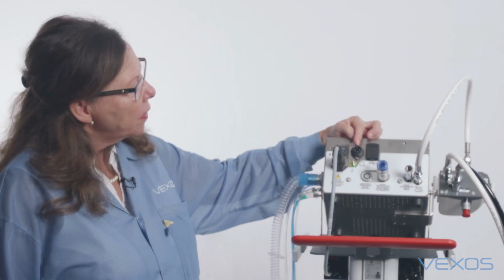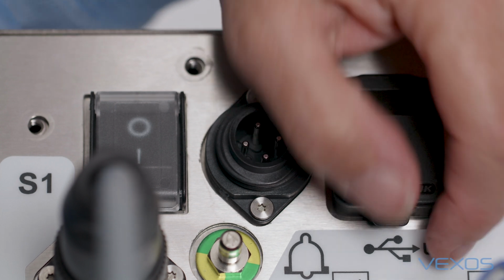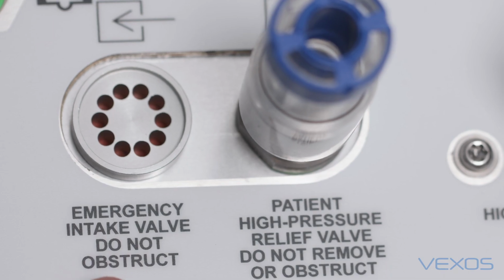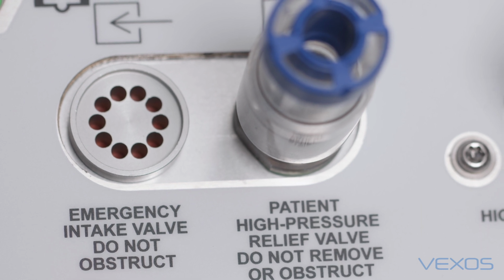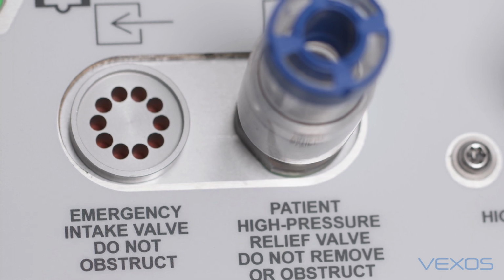The rear of the unit consists of the protective cover for the on-off switch for the ventilator. This is for remote alarms. There's a port for a USB key, the pneumatic source for the ventilator. This is the emergency intake should the ventilator fail completely. The patient can breathe from here. This is a high pressure relief valve, as is this.